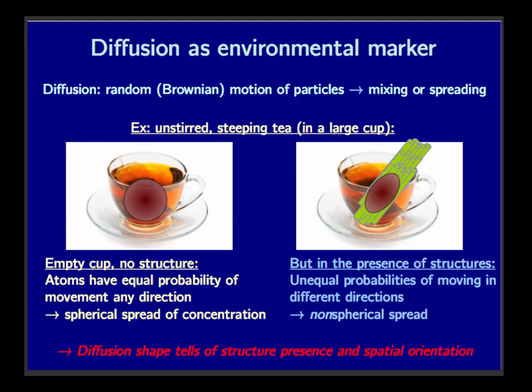And this is really the major underlying model for what's happening, why DTI is useful, because if we can look at the shape of how things are diffusing, we can back-infer about structure. And so that's what we're trying to do. So we essentially have these water molecules, hydrogen, in the brain. If we can tell how it's diffusing locally, we can say, I have straws in my brain here, or I don't have any straws in my brain. And if you have straws in your brain, you should seek medical attention.